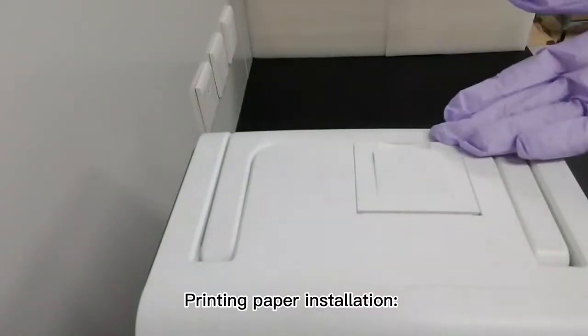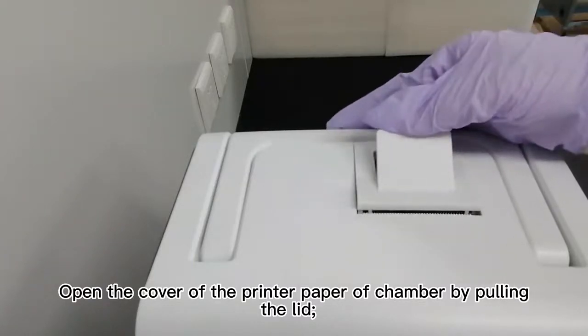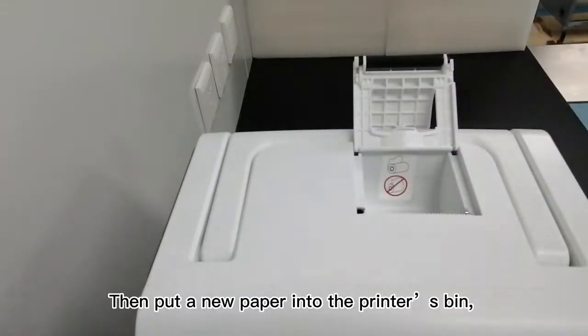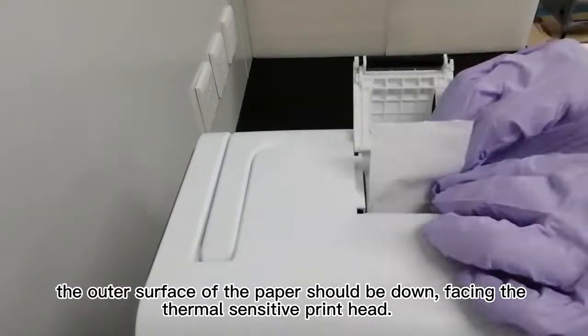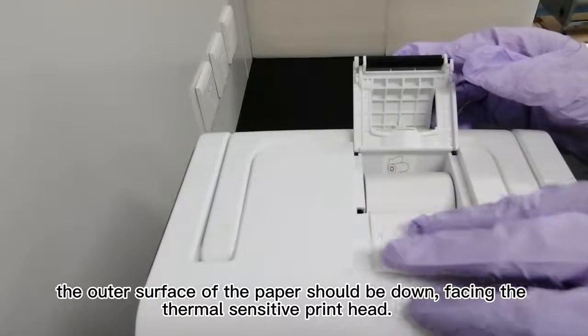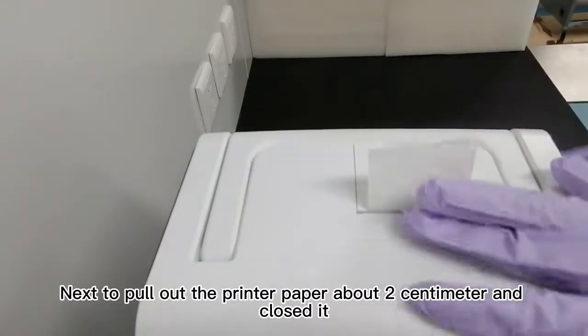Printing paper installation: open the cover of the printer paper chamber by pulling the lid. Then put a new paper into the printer's bin — the outer surface of the paper should face down toward the thermal sensitive print head. Next, pull out the printer paper about two centimeters and close it.